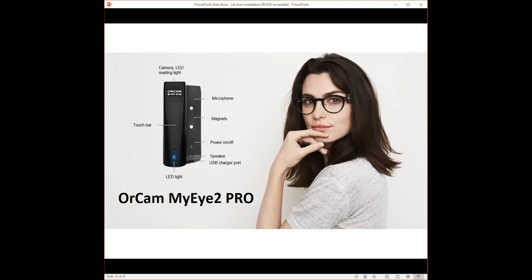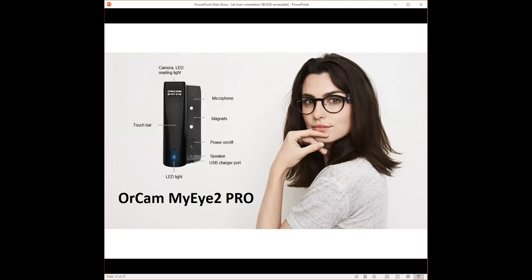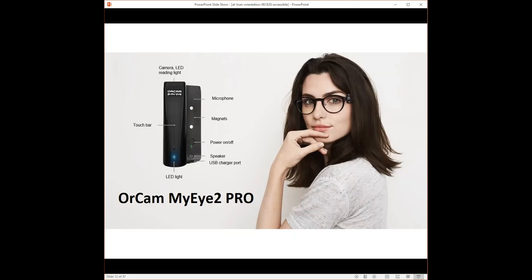Let's go over the device itself. The device has a 13 megapixel camera that is very detailed and picks up very small details. That's in the front, and it faces forward when you're wearing it. So whatever I'm looking toward, that's what the camera will see. It's facing forward like my face. Whatever direction I turn in, the device turns with me. On the device, there are LED lights that act as a flash, and that will illuminate the reading surface when light conditions are low.